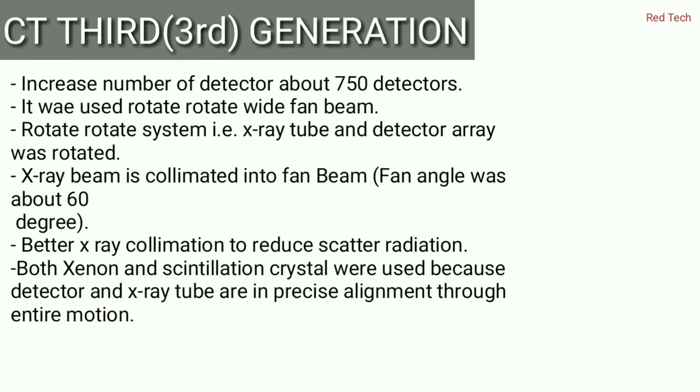So the second generation we call narrow fan beam, and in the third generation we use wide fan beam because the fan angle was greater than in the second generation. But in the first generation there is no fan angle, so we call it pencil beam.